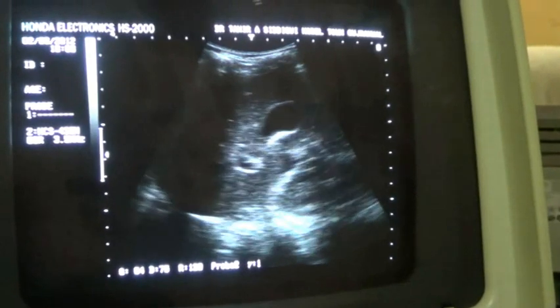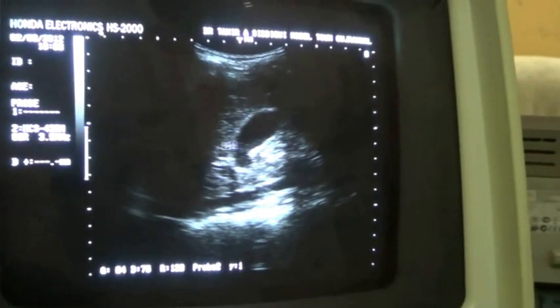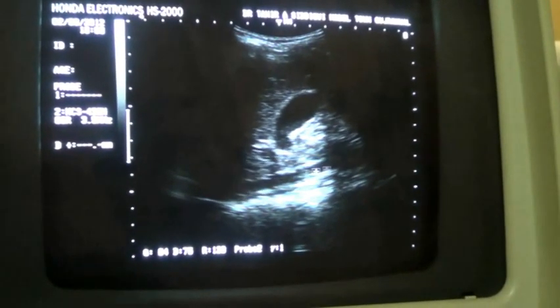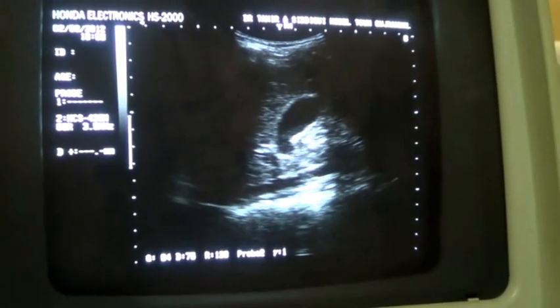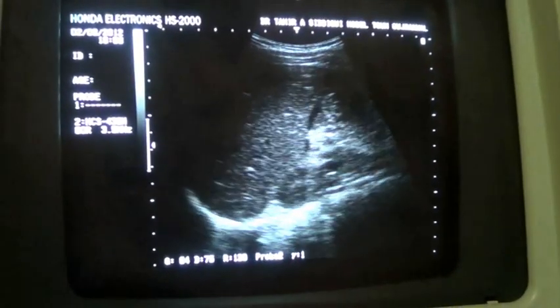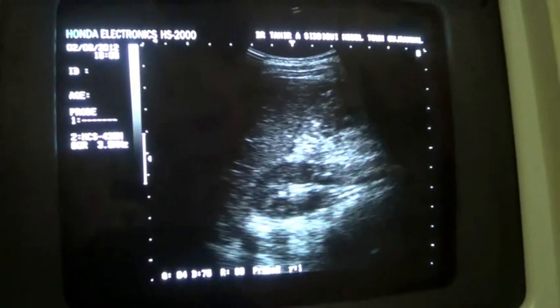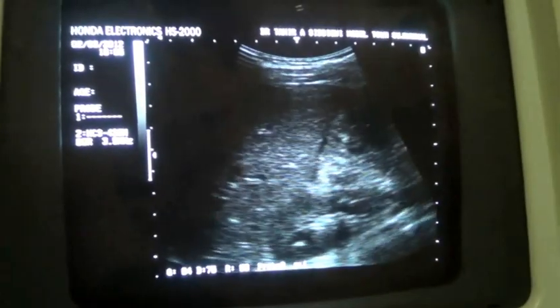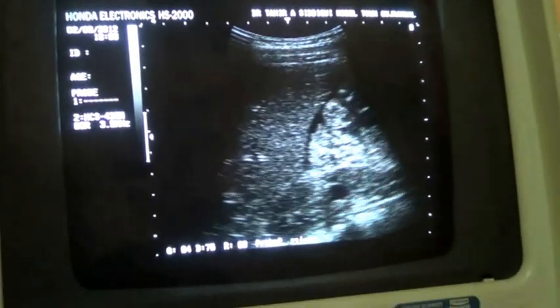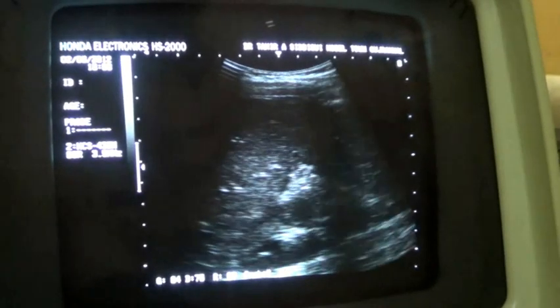Now this is the pancreas — sorry — this is the gallbladder, this is the portal vein, this is the inferior vena cava. The liver is okay, its outer surface is smooth, but as I come to the hepatorenal angle, I do see fluid here in the hepatorenal angle.